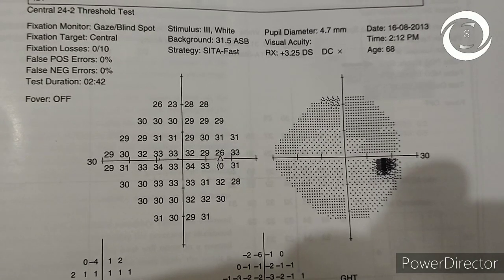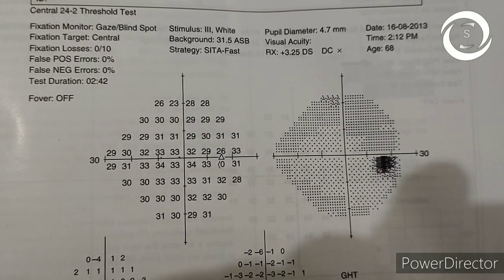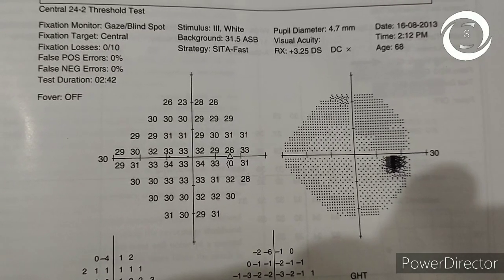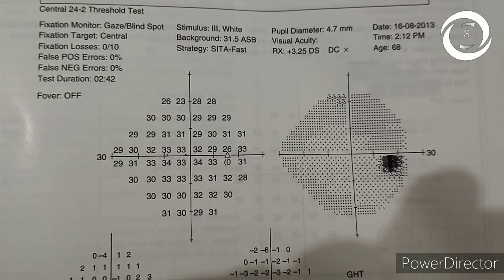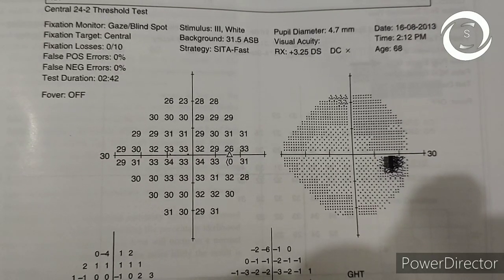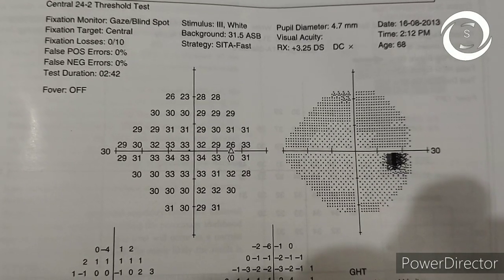If the decibels increase it means the sensitivity is high — retinal sensitivity is high. If you come to the grayscale, on the right side there is a dark spot — that is the blind spot. The blind spot is on the right side, so this is the visual field printout of the right eye.